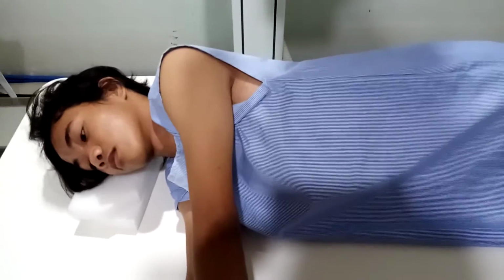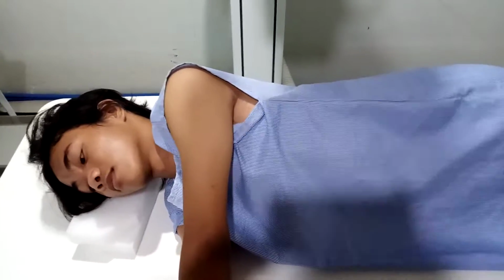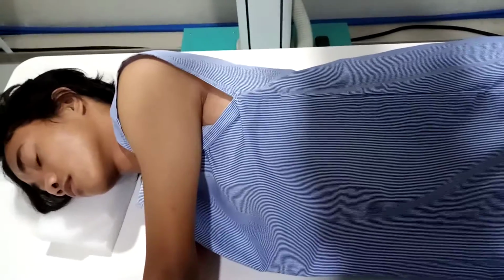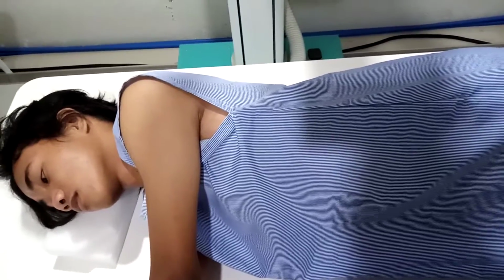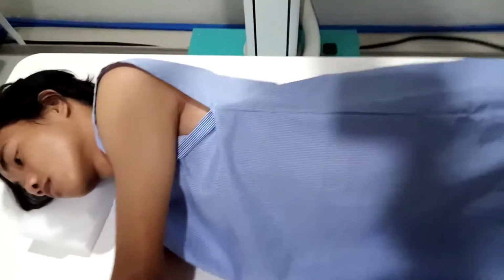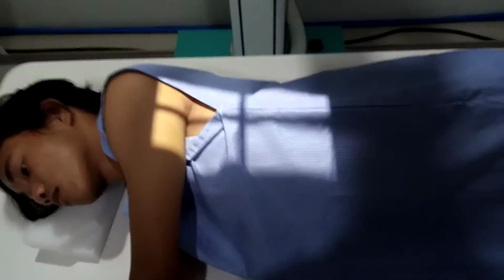So in respiration, instruct the patient. The exposure can be made while the patient continues to breathe normally, a breathing technique to blur the pulmonary vascular markings and ribs, or after breathing is suspended at the end of expiration. So instruct the patient before exposing to suspend his breathing at the end of expiration. The central ray must be centered to the IR at thoracic 7.